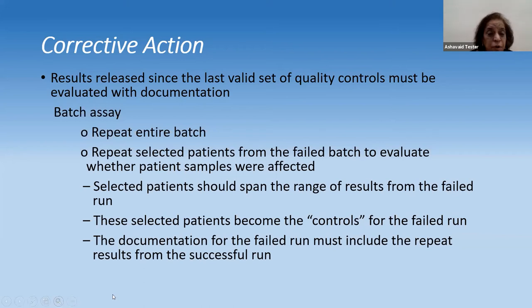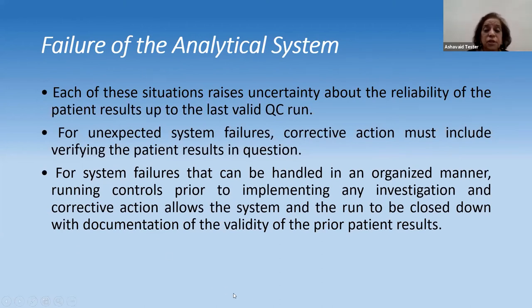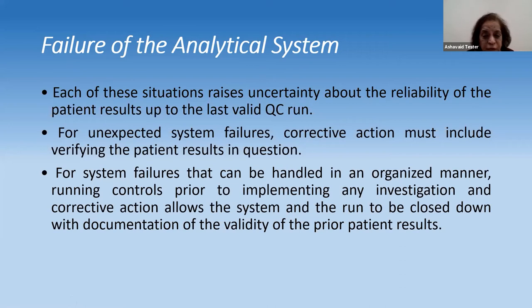For batch assays, repeat the entire batch or repeat selected patients from the failed batch to evaluate whether patient samples were affected. Select patients across the full range of results from the failed run — they become your controls. Documentation of the failed run must include repeat results from a successful run. For unexpected system failures, corrective action must include verifying patient results in question, running controls before implementing any new corrective action, and documenting the validity of prior patient results.